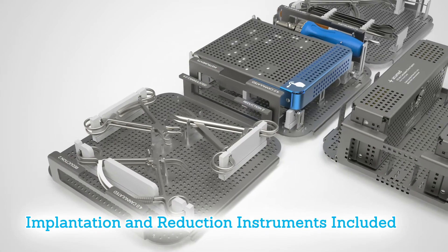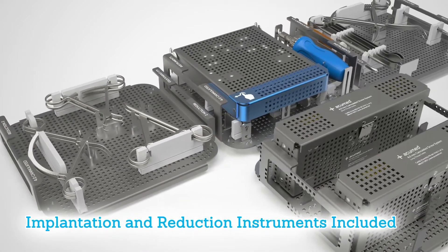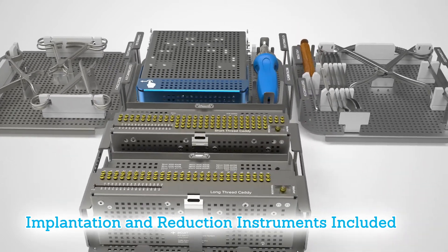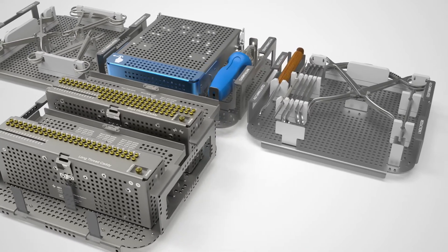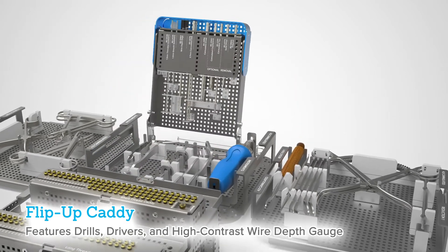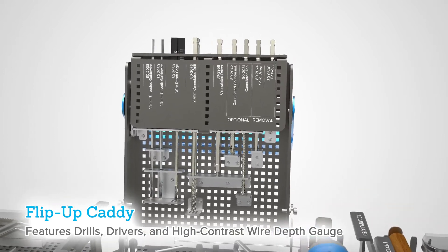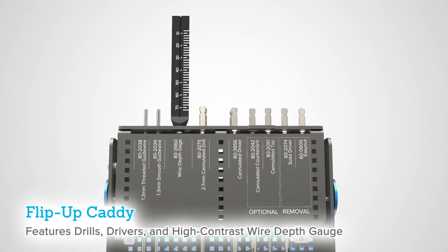An array of implantation and reduction instruments are included, intended to streamline surgery. This system offers common instruments for screw installation, fracture reduction, preparation, and screw removal. The flip-up caddy locks in an upright position for stability on the back table. It features drills, drivers, and a wired depth gauge with large high contrast markings designed to help with readability.